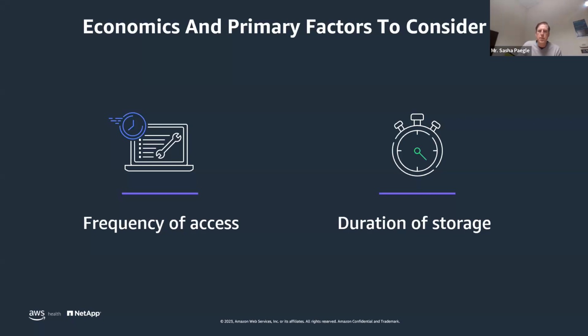Typically those are gated in such a way that they may be higher relative to a different storage class. So the key point and concern here is how often you are accessing those images, because that will influence the total cost to store in terms of your object storage.